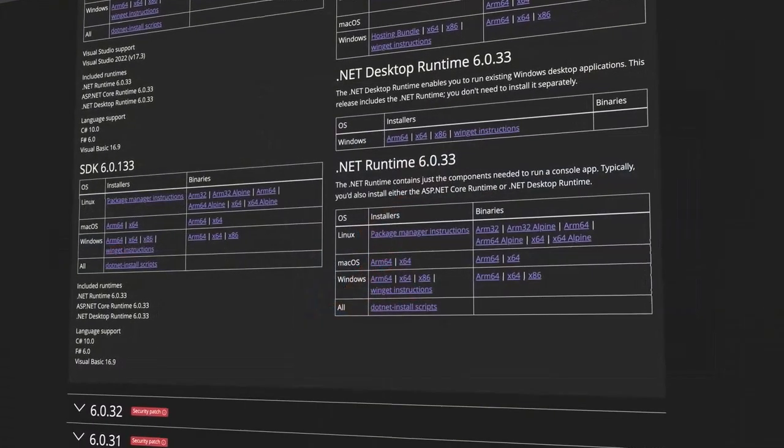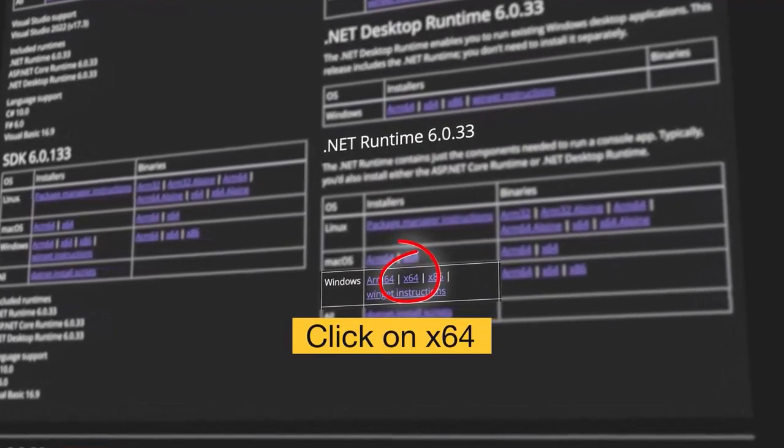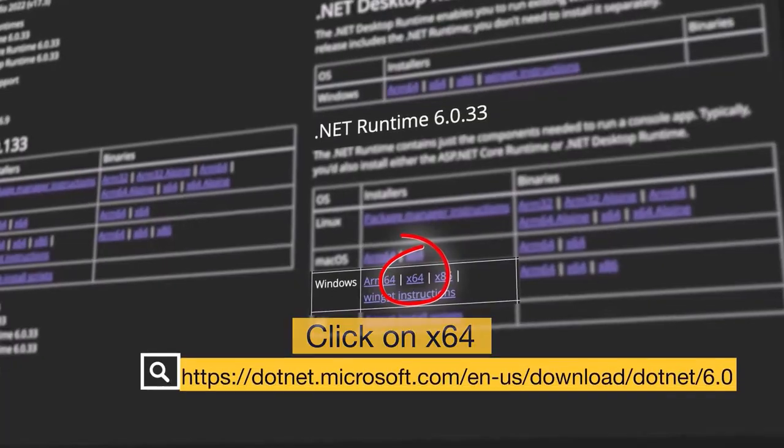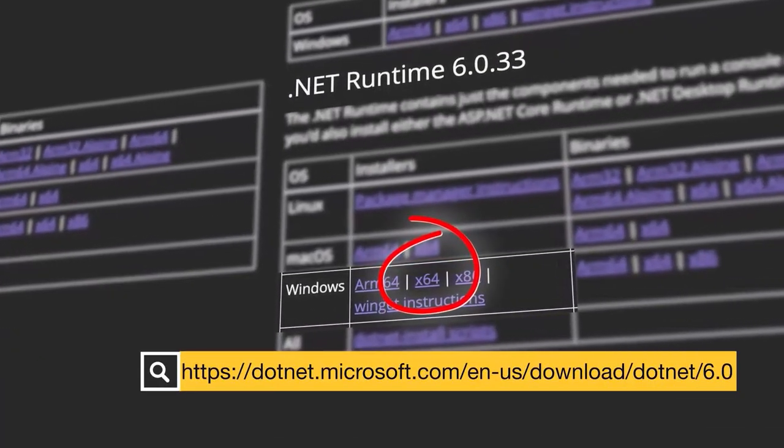For the Fenom Flow software to run properly, Microsoft .NET 6.0 must be loaded onto the Microsoft operating system. .NET Desktop Runtime 6.0 can be loaded from the following website.